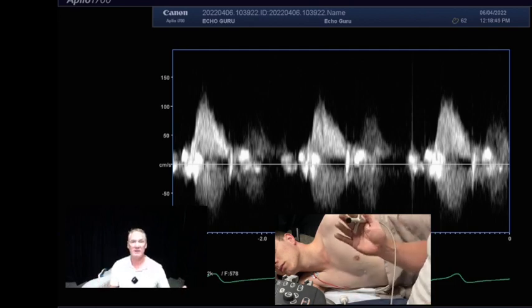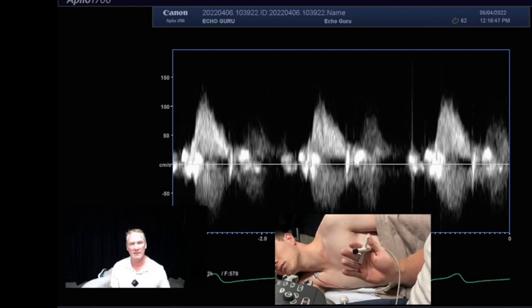So we've covered a fair bit of territory there. Hopefully that's been helpful in looking at the aorta. I'm sure we could talk about the aorta for hours, just a short video today though, and hopefully there's been a couple of useful tips.